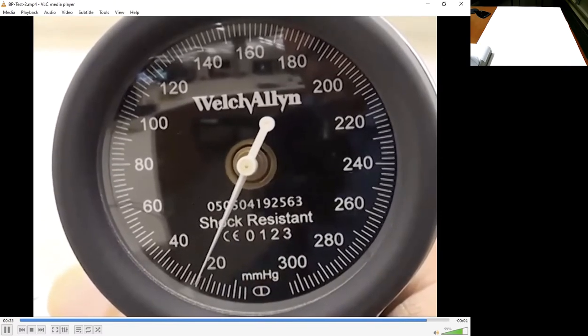All right, how'd you do on that one? Did you get 124 over 86? 124 over 86 would have been spot on. And again, if you're within two, above or below, that's great. If you're within 10, dude, no, we've got to do a little better than that. So try to get a little bit closer.